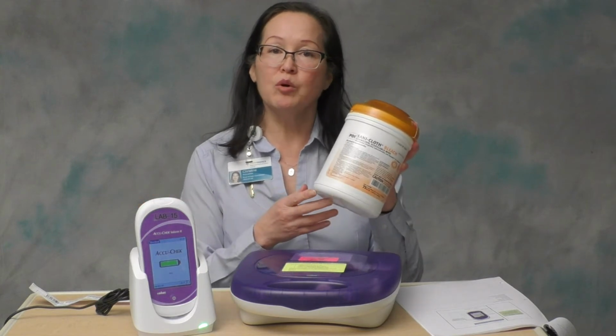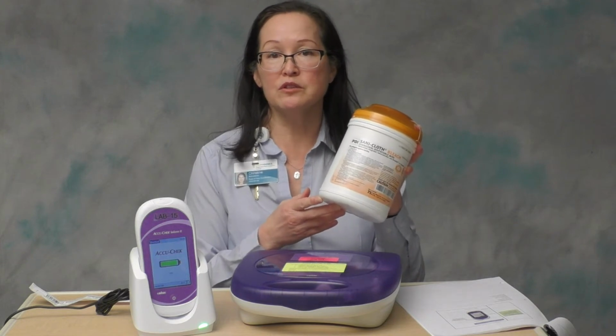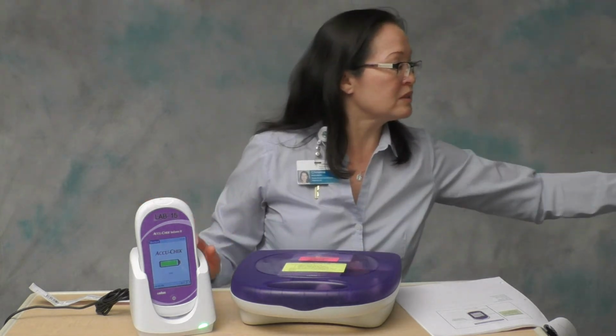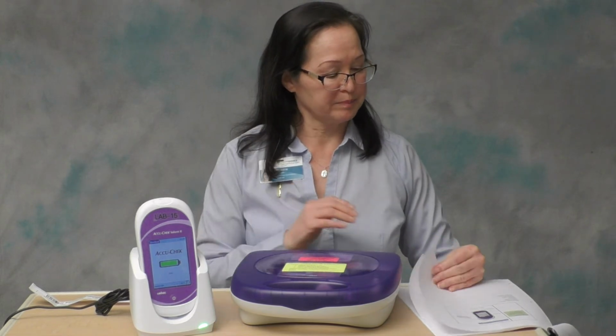So bleach is the only disinfecting agent that effectively kills C. difficile spores. For that reason, we require the use of bleach on these instruments in order to ensure we're not transmitting C. diff spores from one patient room to the next.